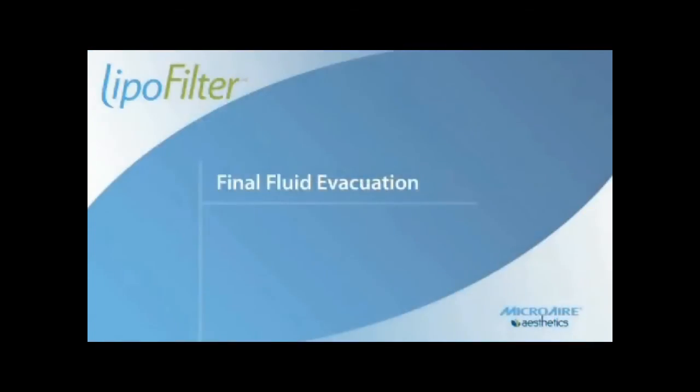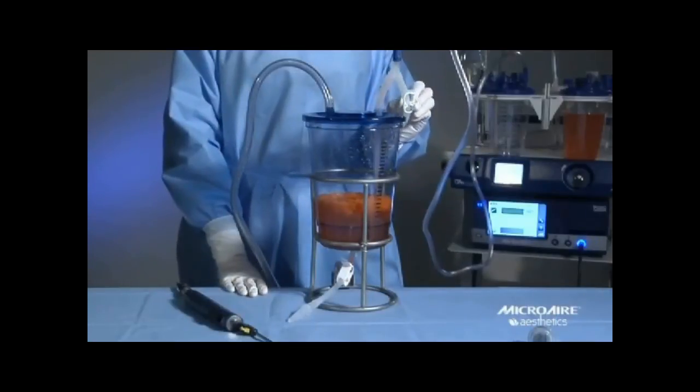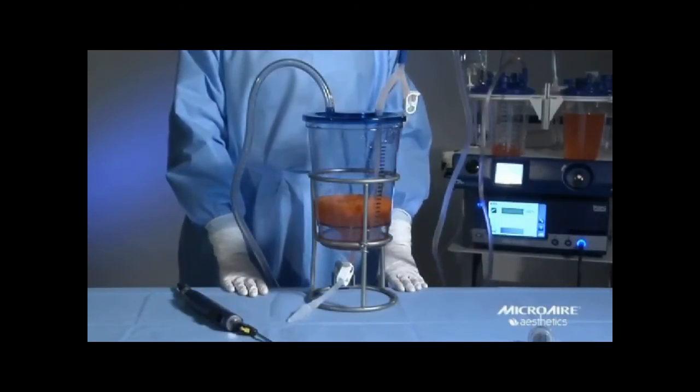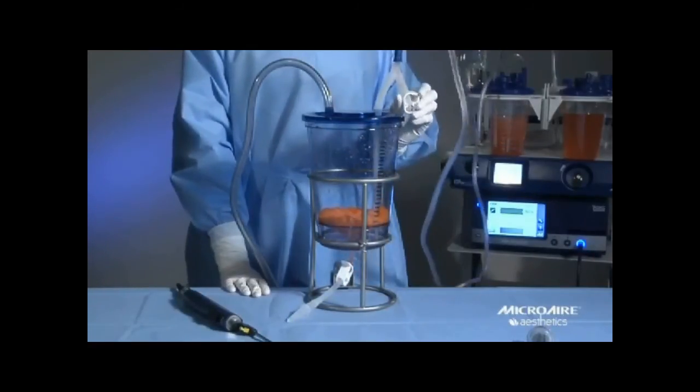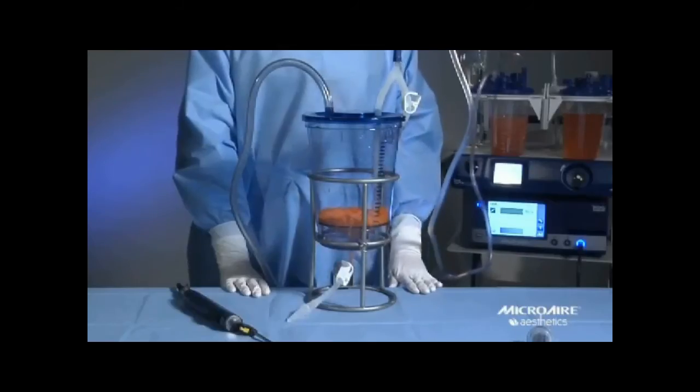For the final drainage, close the pinch clamp and drain the fluid. When the fat reaches the funnel, open the white pinch clamp and turn off the aspirator. This is important so you do not have a vacuum block when you extract the fat.